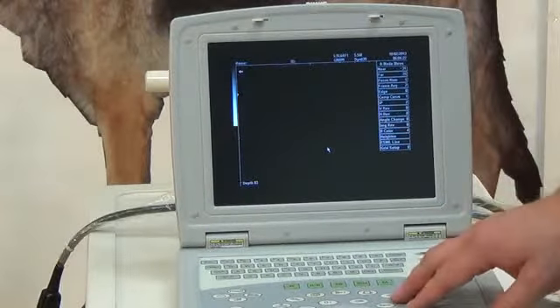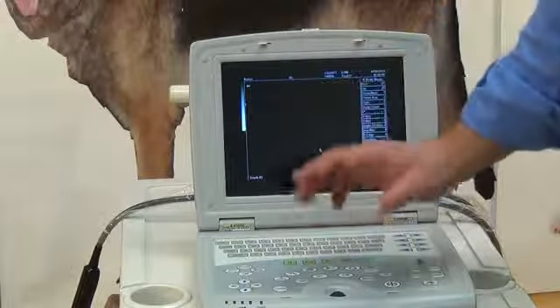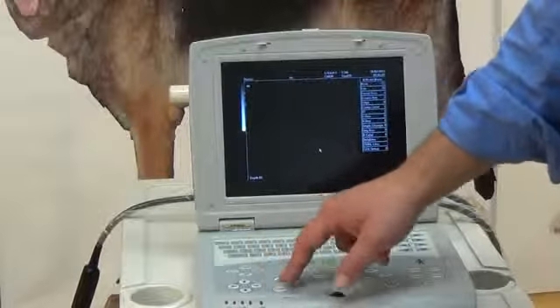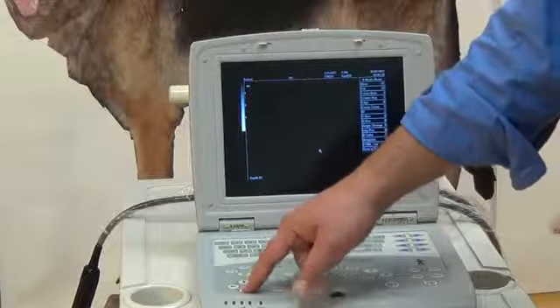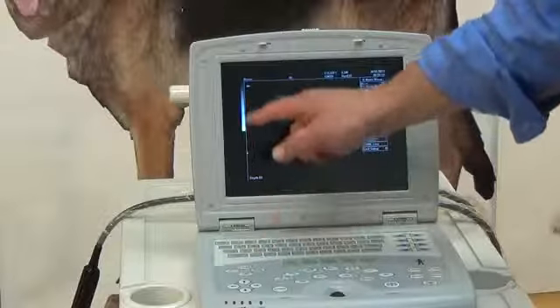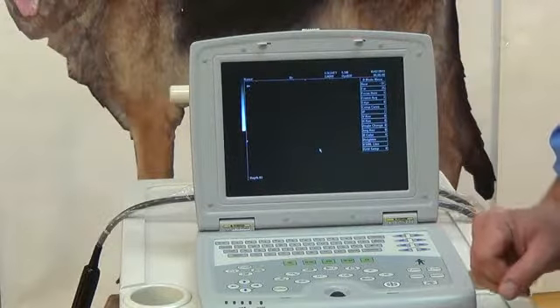Getting to the middle here, we have a focus button. So focus is on the left side. That's the sharpest and clearest area of the image, depending on what type of setting you have. So you can have 1, 2, 3, and you can move those when you have just one with the arrows to the left here, so you can see it going up and down. And you usually want that pretty much at the area that you're looking at as a basic function.